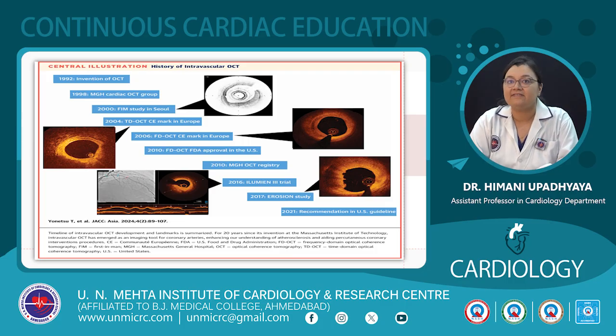In 2006, frequency domain OCT, which is used nowadays, got its CE mark in Europe. In 2010, FD OCT got its FDA approval, and then the MGH OCT registry was formed with the ILUMIEN III trial and EROSION study. The various uses of OCT expanded, and in 2021 it got a recommendation in US guidelines.